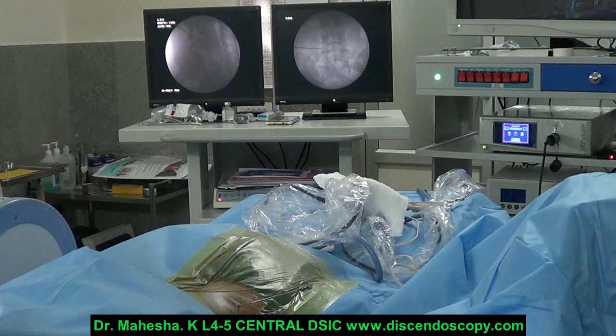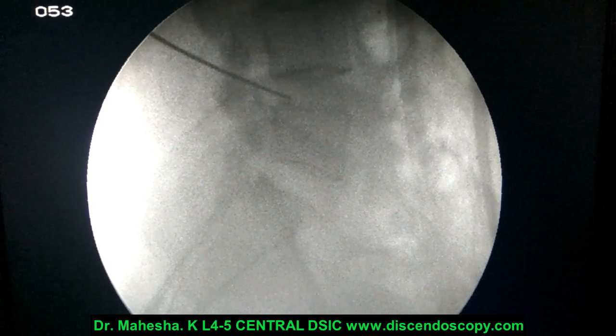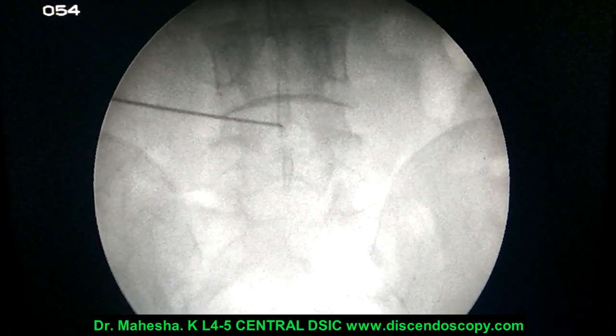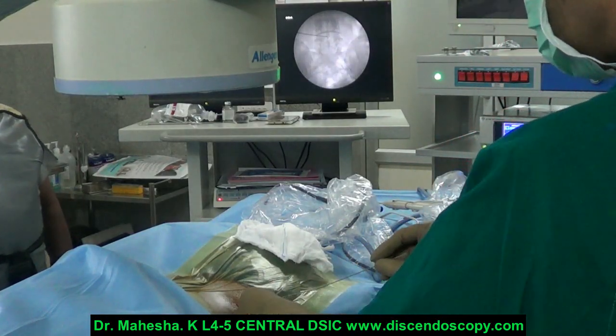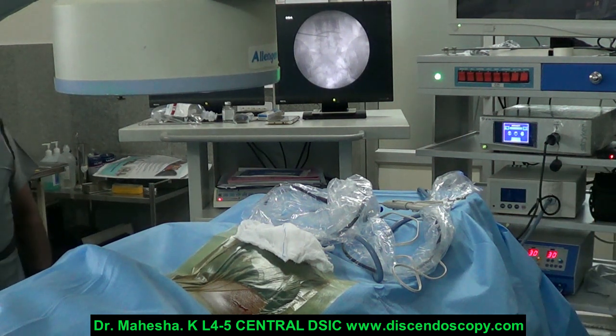I am inserting an 18 gauge needle into the L4-5 disc space under image control. The entry point is about 12 cm lateral to midline. You can see in the C-arm pictures that the tip of the needle is in the midline in the AP view and in the posterior 25% of the disc in the lateral view.